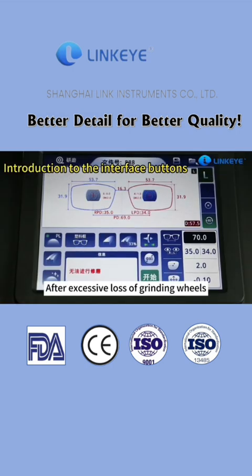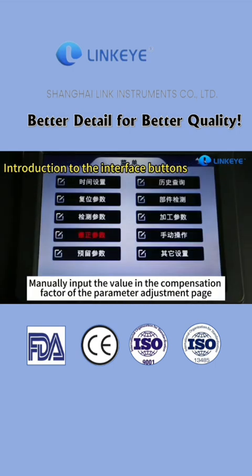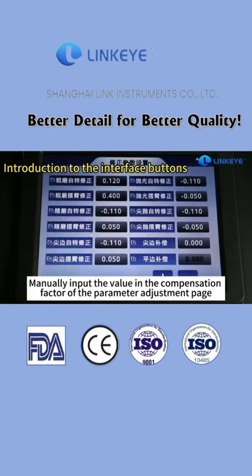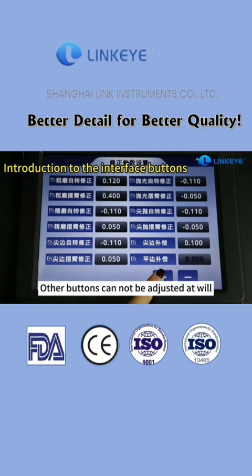After a long time of extensive wear of the grinding wheels, all the processed lenses will be bigger. Then every time you grind a lens, a fixed parameter is added to the correction value. Manually input the value in the compensation factor of the parameter adjustment page, so you don't have to add a correction value every time. Other buttons cannot be adjusted at will.